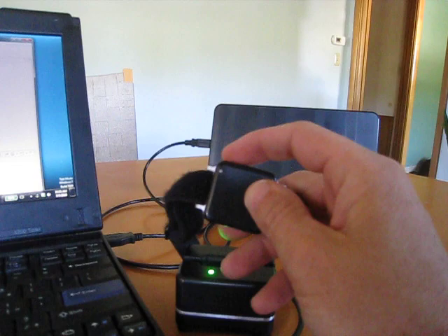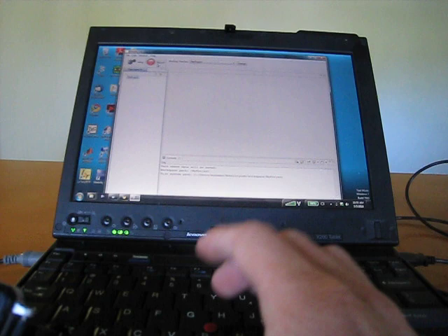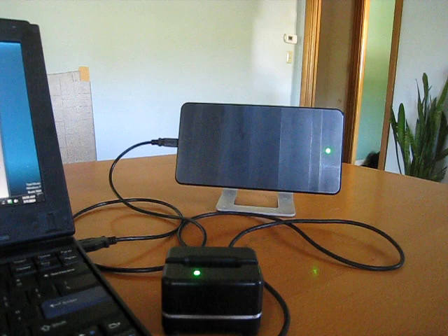On the application software I'm going to hit the record button and this brings up the record window. You can see over here now the access point is blinking rapidly green, which means it's receiving data.